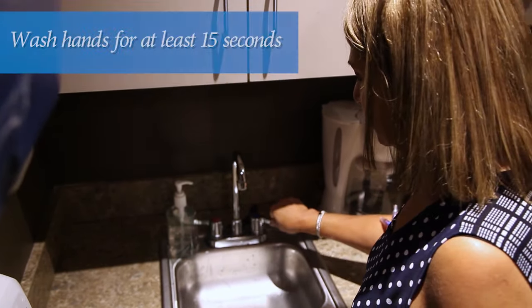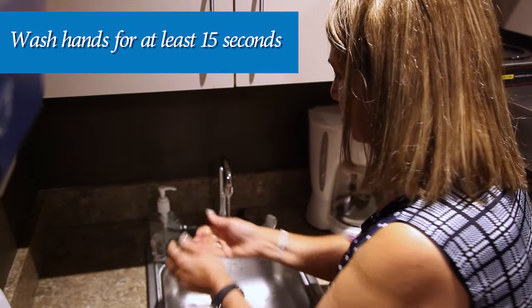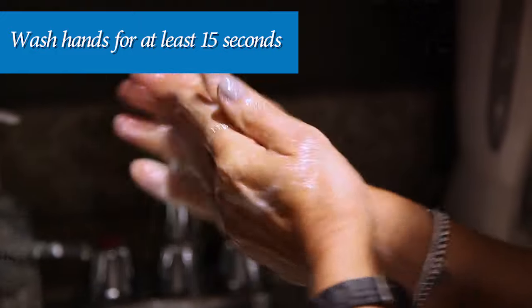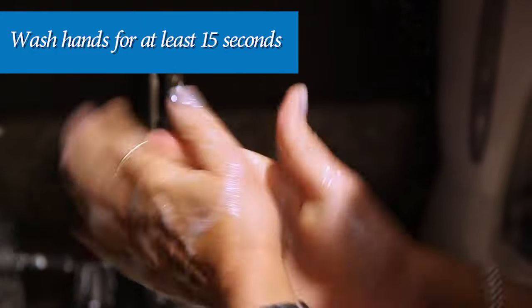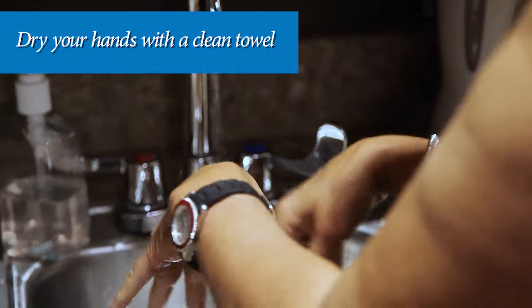The next step is one of the most important steps in the process. Wash your hands with soap and water, making sure that you wash for at least 15 seconds. After washing, dry your hands with a clean paper or bath towel.